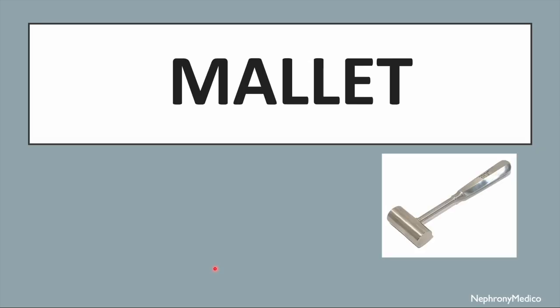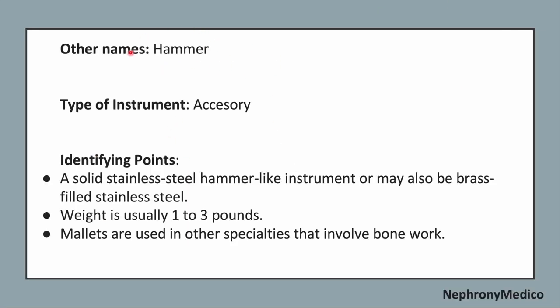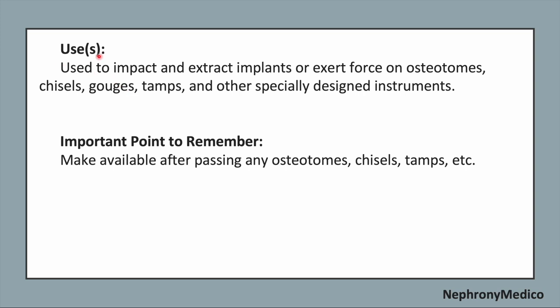Let's talk about mallet. This is a picture showing a mallet. Now, the other name of this instrument is hammer. It is an accessory type of instrument. Now, identifying points. A solid stainless steel hammer-like instrument, or may also be brass-filled stainless steel. The weight is usually 1 to 3 pounds, and mallets are used in other specialties that involve bone work. Now, use. It is used to impact and extract implants or exert force on osteotomes, chisels, gouges, tamps and other specially designed instruments. Now, important point to remember. Make available after passing any osteotomes, chisels and tamps.